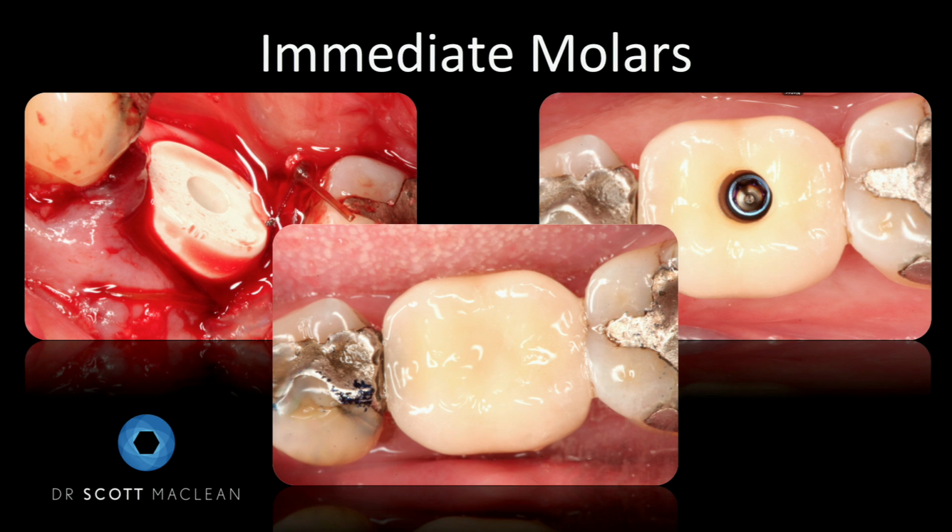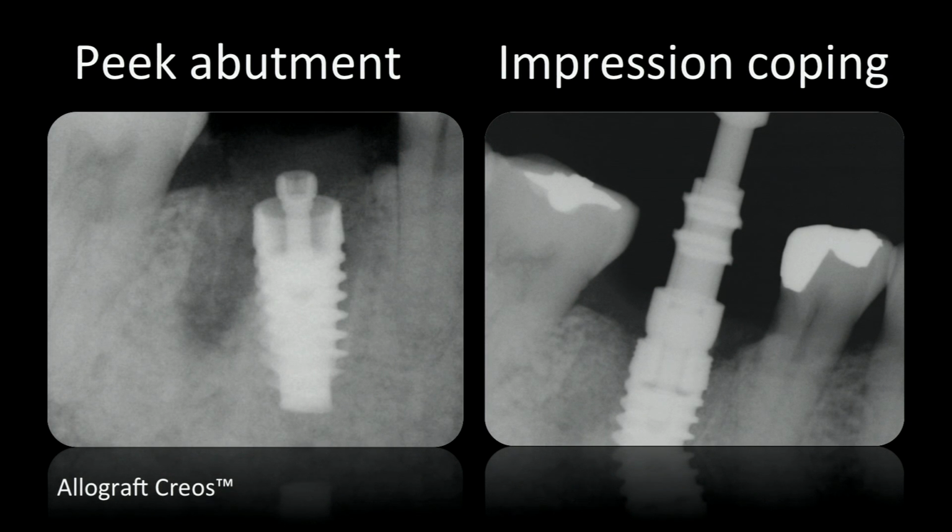And finally, when I fill this in, look at where it goes. It looks exactly like a tooth. We can't see a channel on here. Patients are not concerned about this. So it's a very fabulous type of system. We can see here, finally, on the x-rays from placing the implant to when I take the impression, the bone is staying at the top of this implant, which is the ideal position.